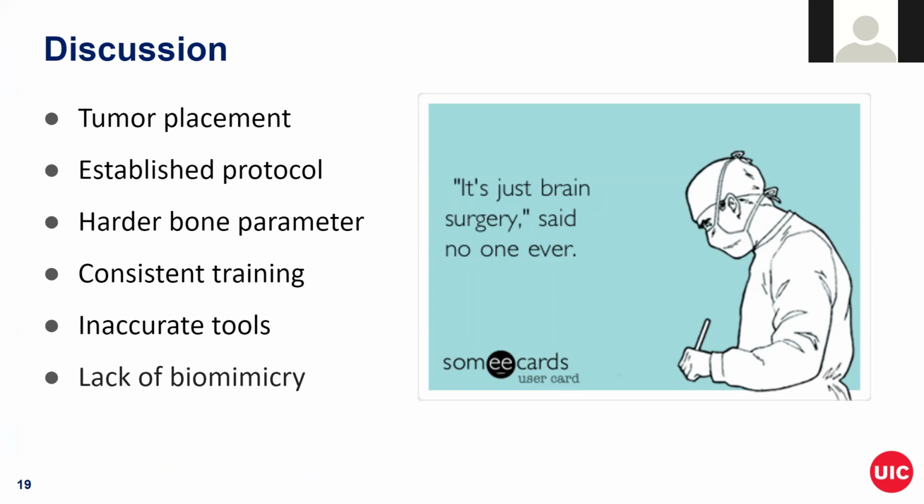For our future models, we want to implement a model of metastasizing tumor in order to mimic a more intricate brain surgical procedure, and we already have a plan for it. We also want to work on our protocol so that it accurately follows the actual surgical procedure from start to end. Currently, our tools are good enough to meet the requirement of the current protocol, but as we improve our design, we will need more complex tools.